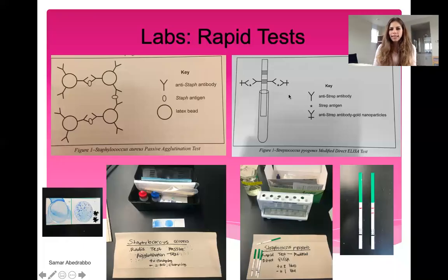Hi everyone, this is the rapid tests lab. In this lab, we are going to do a demonstration about tests that are called rapid tests because you get the results very fast. You get them almost immediately.